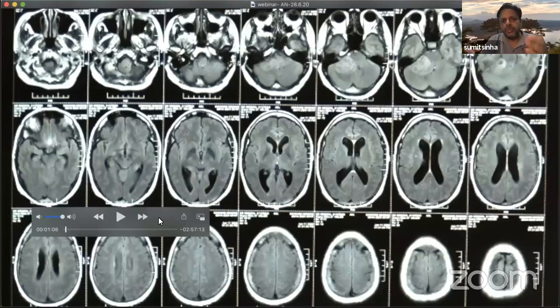Before you make a craniotomy, or you might have to temporarily insert a drain into the ventricular system before you open the dura and go on to remove the tumor. Sometimes it does help to make the brain lax before you enter the dura and go on to excise the tumor per se.